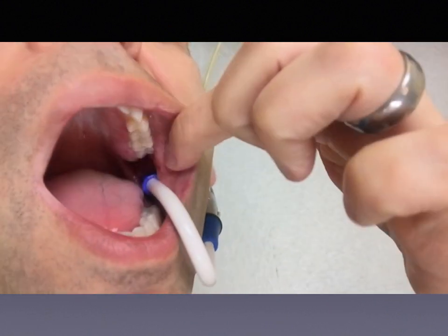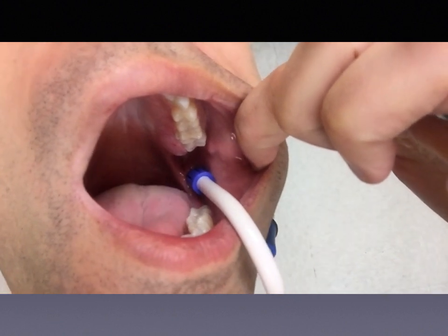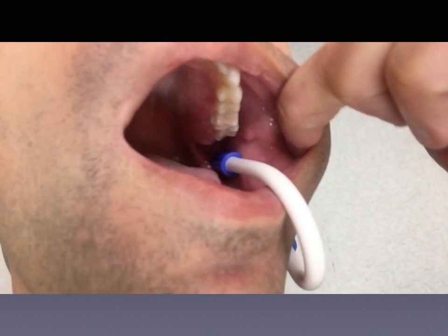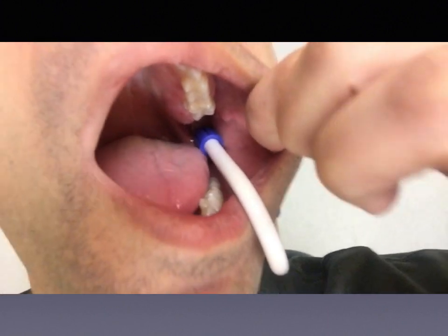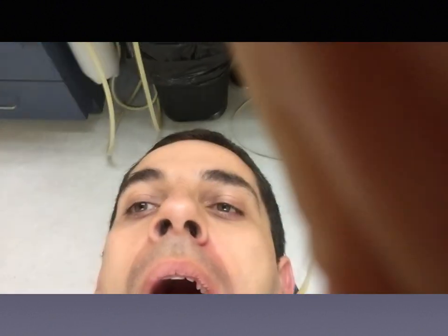The ReLeaf system obviously clings to the teeth better, but the Total Comfort stays in place pretty well as long as you bend it correctly. You can see me trying to get tissue stuck on my tongue by pushing against it, but it's really tough — it does a great job. It's much better than a standard saliva ejector and only about two cents more. Getting your employer to buy this is going to be a lot easier than convincing them to spend $1 each on the ReLeaf.